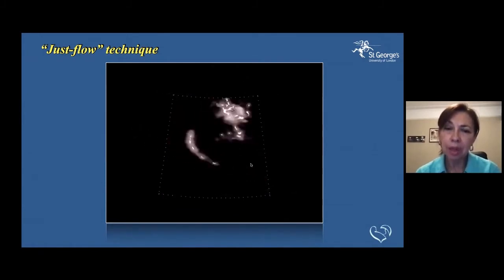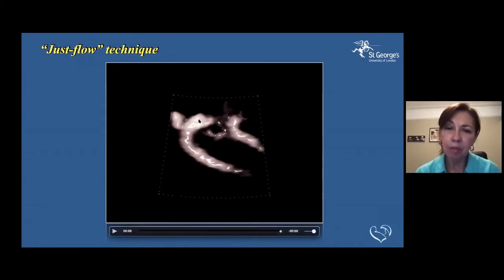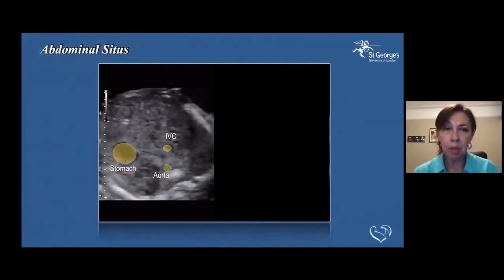And you can see at the end how many more details we have of this aortic arch. It's very simple, you don't need any fancy equipment, just by reducing the gain on the cross-sectional image, and if necessary, the TGC as well. So very useful, very beautiful, very pleasing to the eye. It gives more details, as we'll see in subsequent images.